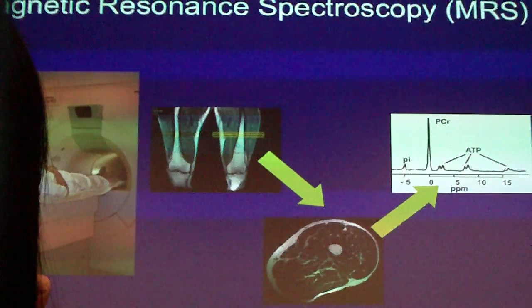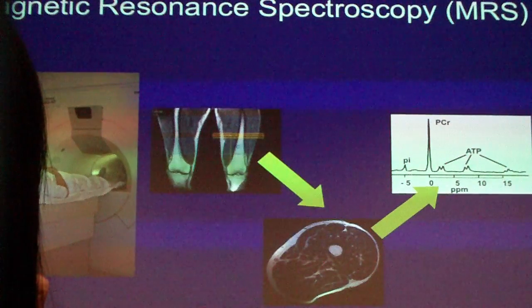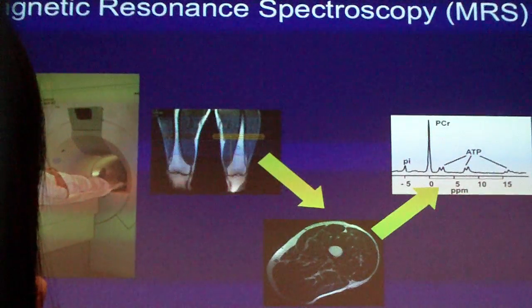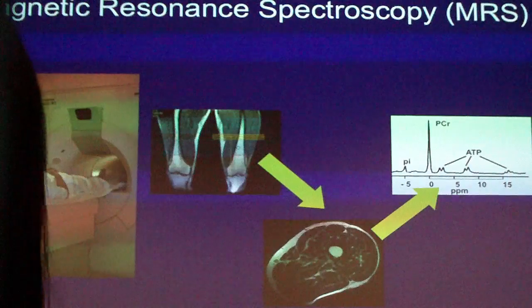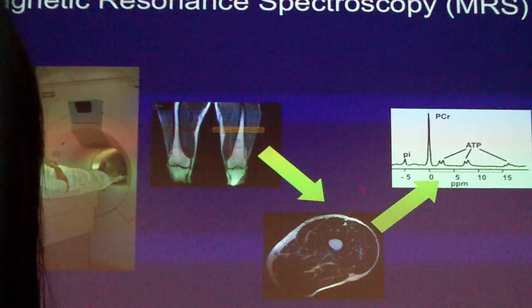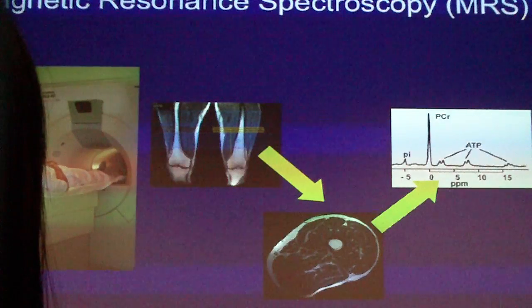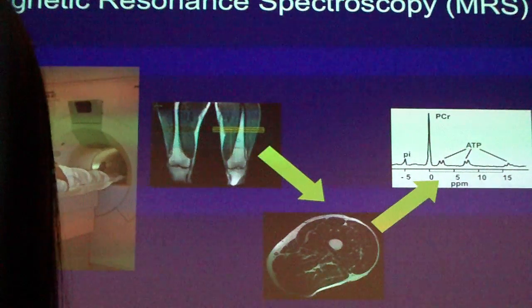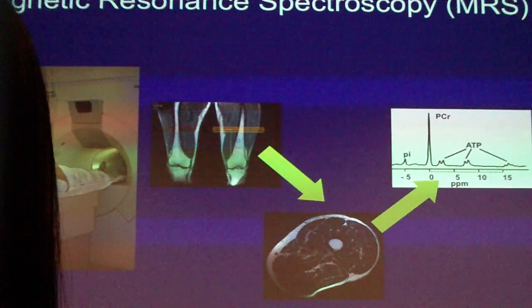So the question is, why do we see this contrast? From the bone itself, you get no signal. It's the black, and inside the bone is the bone marrow, which is also a lipid kind of structure, which gives you also a bright signal. So this is MRI with the same physical principles, which I will explain a little bit. It's only a very short time, so I will only explain a little bit.